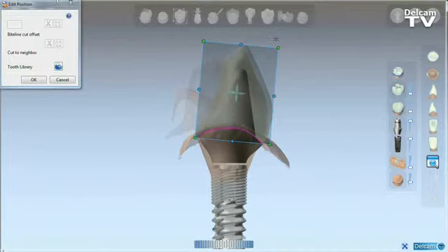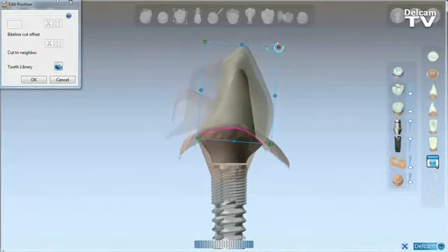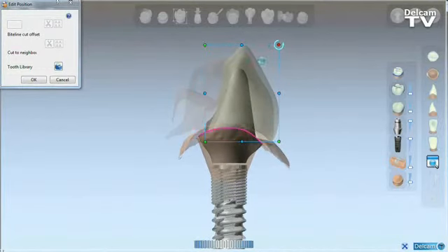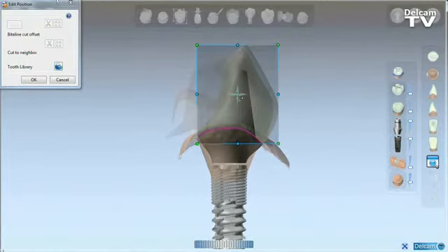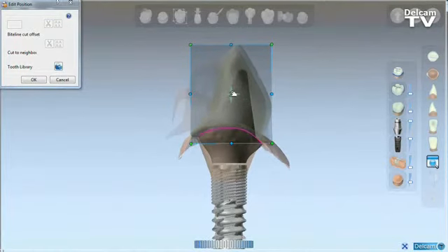As you reposition, reshape, and resize your coping or crown, the abutment also resizes and reshapes according to how your restoration is shaped.